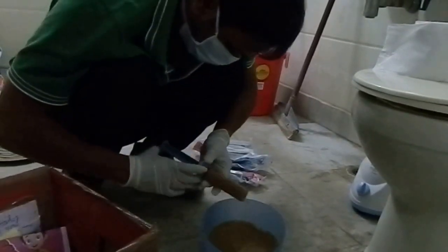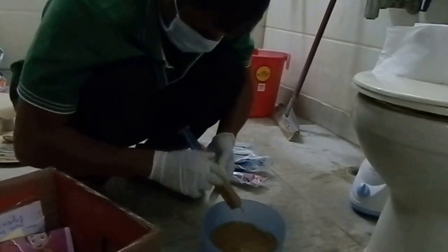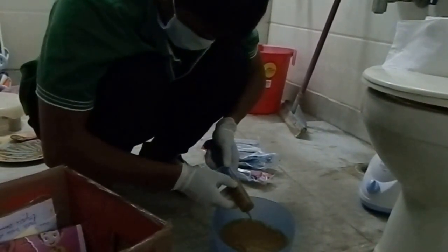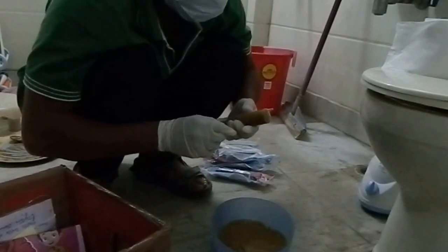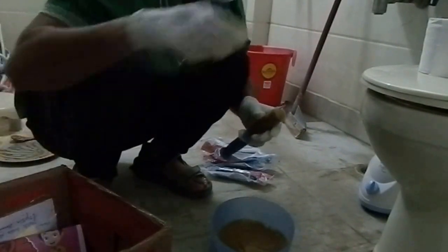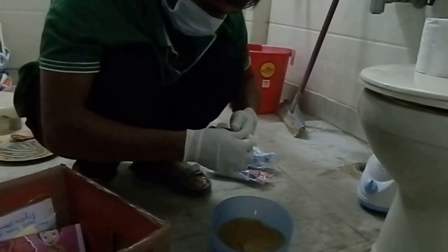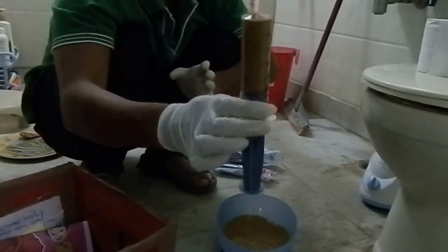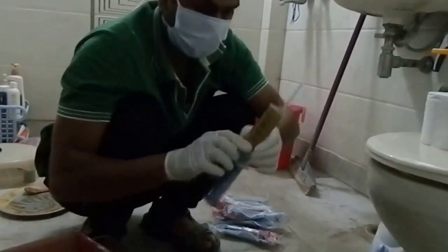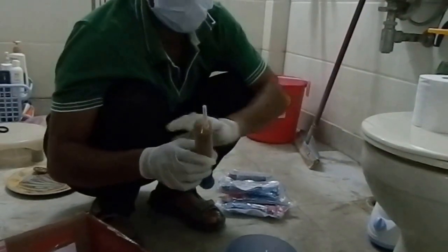This is approximately 60 ml. What you want to do is bring it down to approximately 50 to 53 ml and then you are in the ballpark. Then you close it. And we are done with one set of syringes with approximately 50 ml of strained blended poop. This is the exact same steps we are going to repeat for six more syringes. Thank you guys.